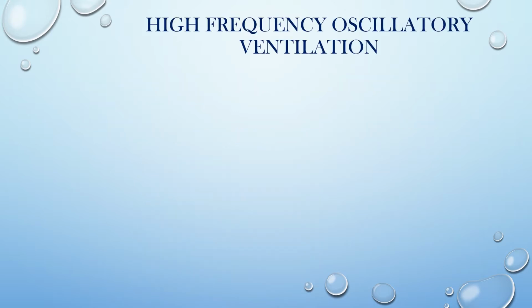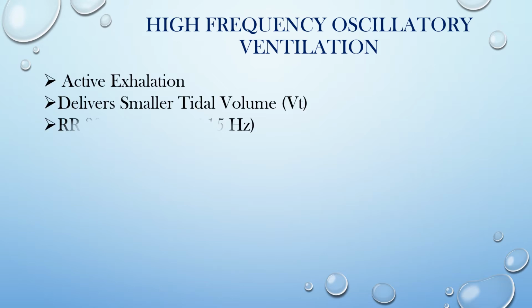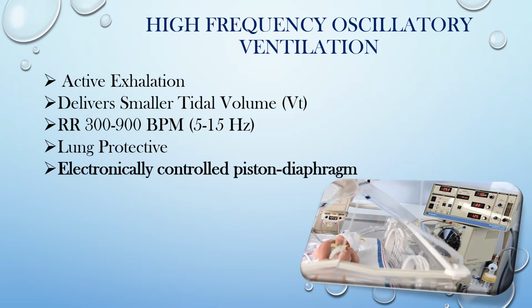The high-frequency oscillator uses active exhalation and delivers small tidal volumes, with respiratory rates from 300 to 900 breaths per minute, which are represented as hertz on the ventilator. It is lung protective. Exhalation is by an electronically controlled piston diaphragm.